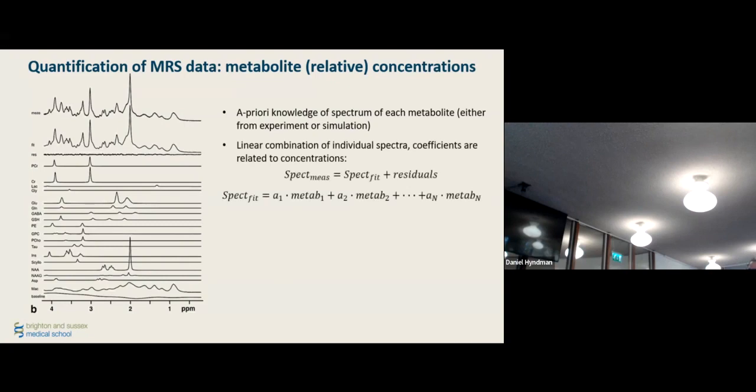And the model is that the spectrum, as we measure it, will be a fitted spectrum plus some sort of noisy residual. And the fitted spectrum will be the sum of all the individual spectra of the individual metabolites, which you can obtain by phantom, scanning them one after the other. N-acetyl-aspartate, prepare phantom, scan. Prepare phantom, scan. Not anymore. No one does it anymore.